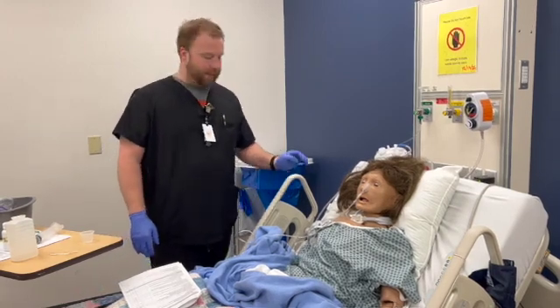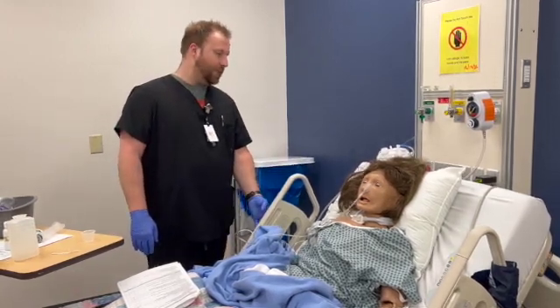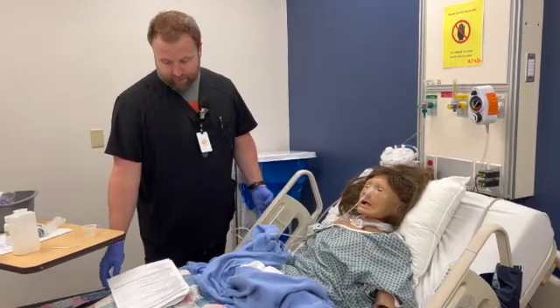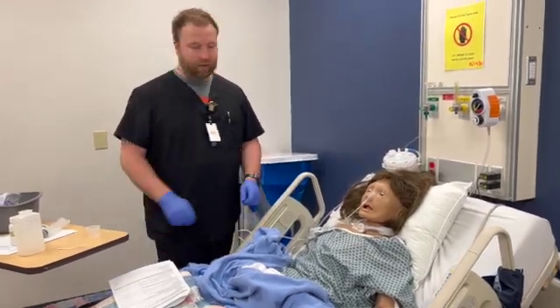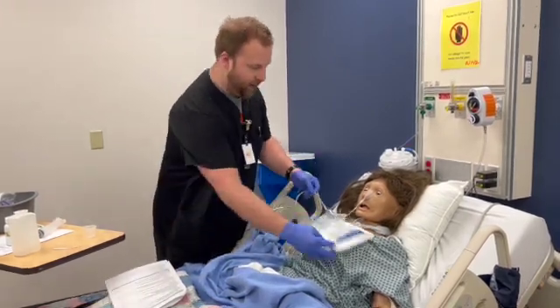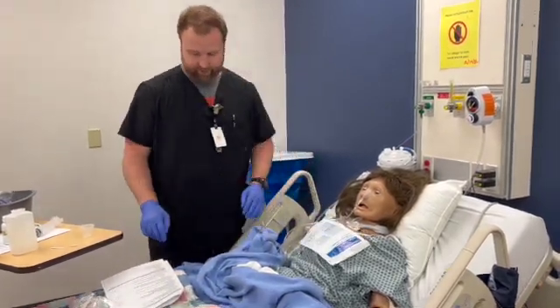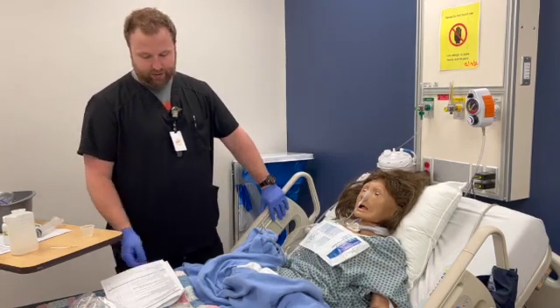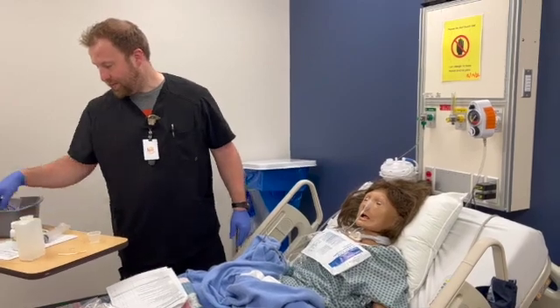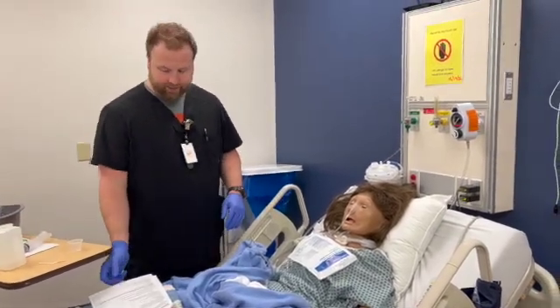I will place the patient at 30 to 45 degrees. I'm going to place a towel over my patient's chest or a disposable pad, and I will hand the patient an emesis basin and some tissues.